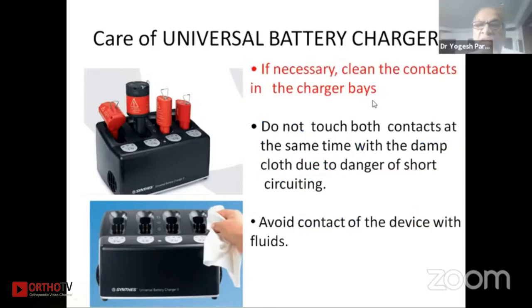If necessary, clean the connecting points in the charger with a soft cloth. Do not touch both contacts at the same time — if you try to clean you may accidentally touch both contacts, which one should avoid. Damp cloth should not be in contact with the two charging points as there may be danger of short-circuiting. Avoid contact of the device with fluid.